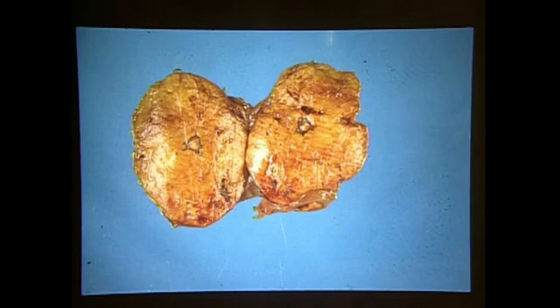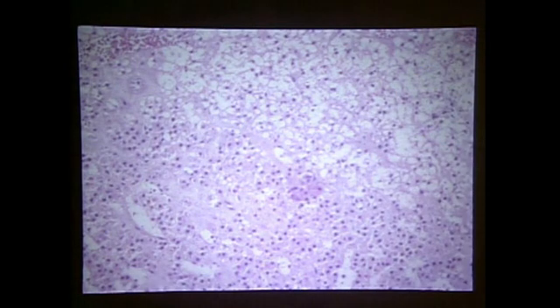Tumors, like in other animal species, may start and arise from the cortex. As such, they are usually expansile growths, revealing themselves by the presence of a yellow color and a close association with the cortex. Here it's a more aggressive type of tumor arising from the cortex. That may be very well a cortical adenocarcinoma, destroying somewhat the entire adrenal. Again, usually unilateral. The histologic presentation of a cortical adenoma.